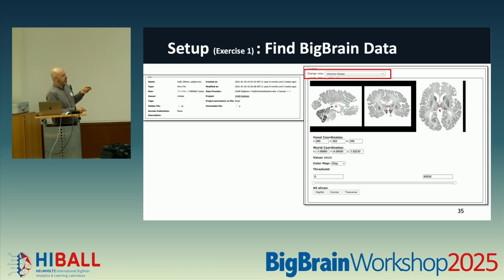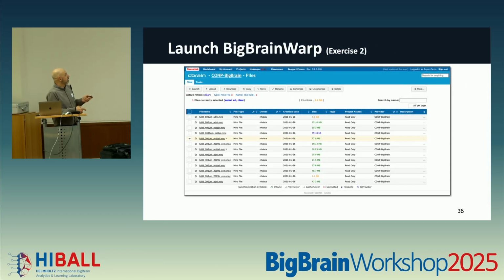We're doing some extensions now. So for example, we have some projects that don't have the NIfTI output yet. They were working directly on DICOM files. So we have a DICOM viewer that is in its prototype stage right now so that people can then work directly on the DICOM files. Okay. So even if you arrow back, you should get back to the same view in this case.